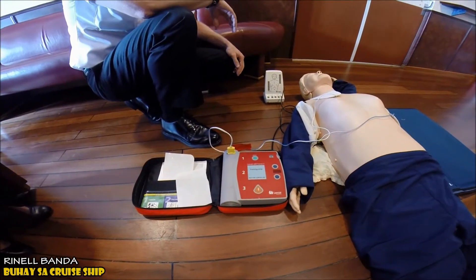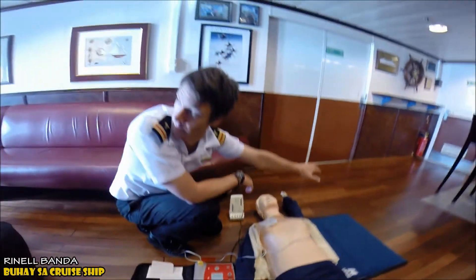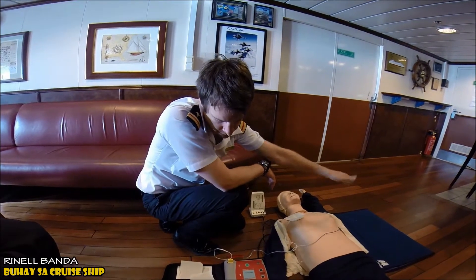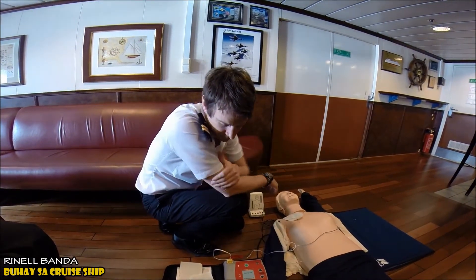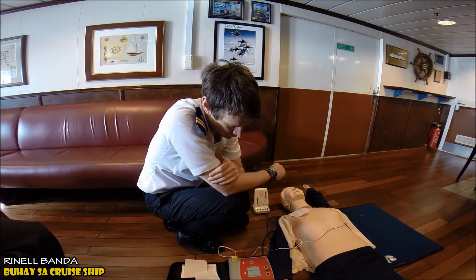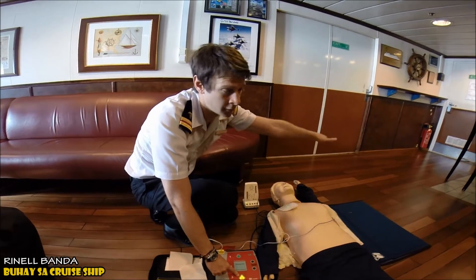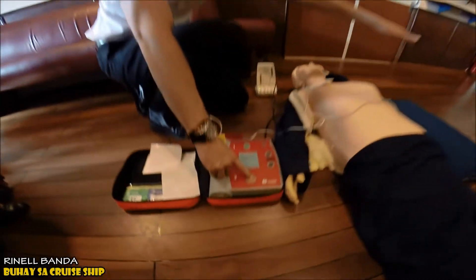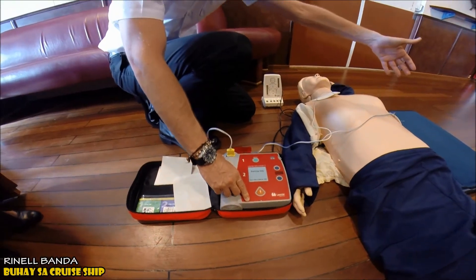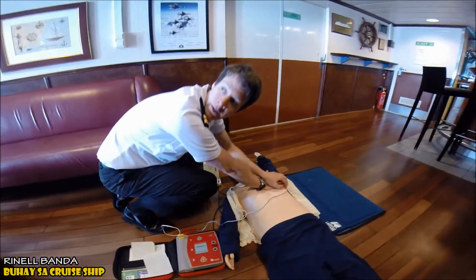The AED will analyze the heart rhythm — do not touch the patient during this time, so we stop CPR. If a shock is advised, the machine charges and instructs everyone to stay clear of the patient. After delivering the shock, if needed, start CPR and get back on the chest.